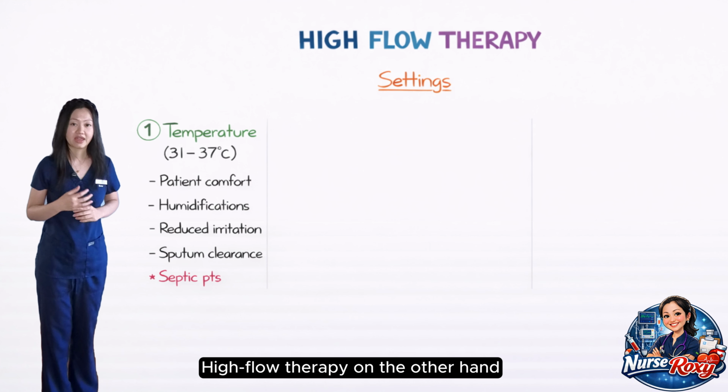Have you ever heard of a high flow therapy or a high flow device? In this video, I'm going to discuss what it is and when you should use it for your patients.